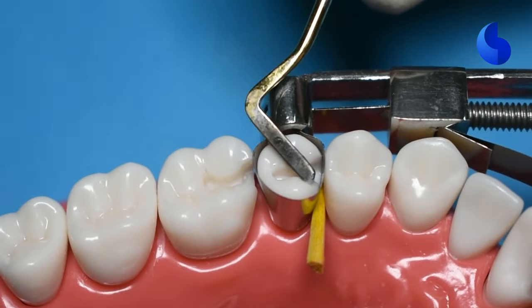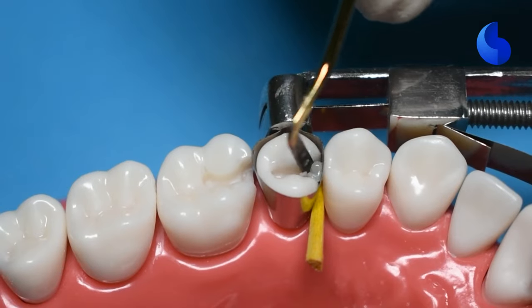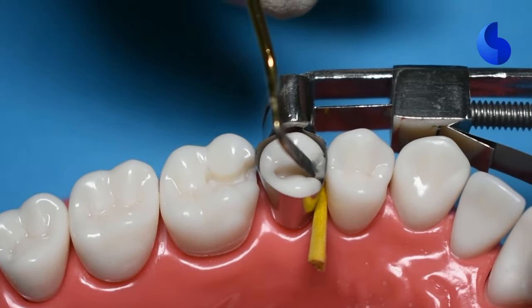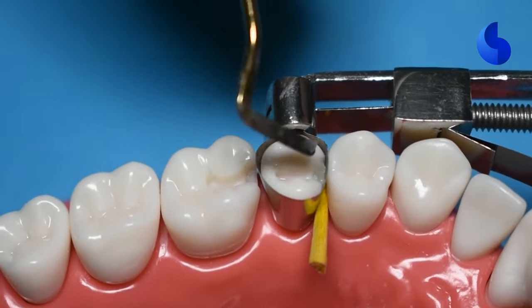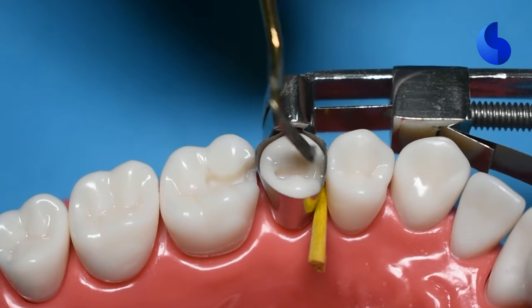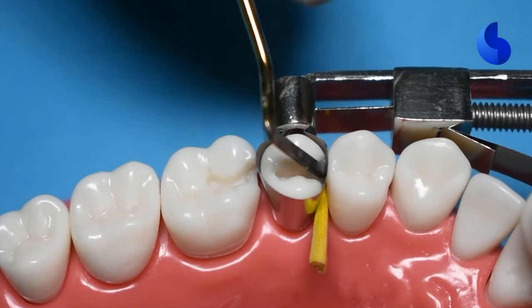When you're ready to fill, take your plastic instrument and place a little bit of composite restorative material in your cavity and place it in the proximal box area. And then start condensing it in the proximal box area. It's best to start here because this is where you want to make sure you have a good seal, and it's also the part where you're missing a wall.